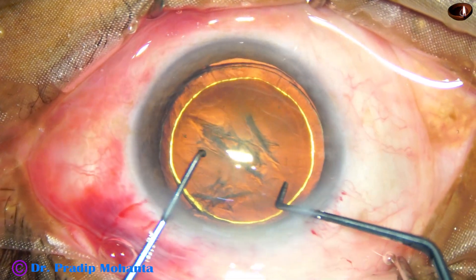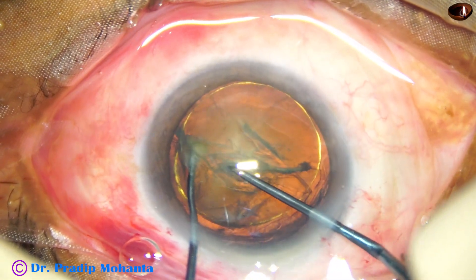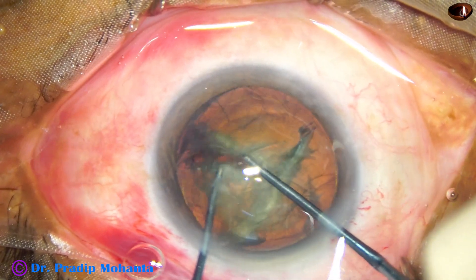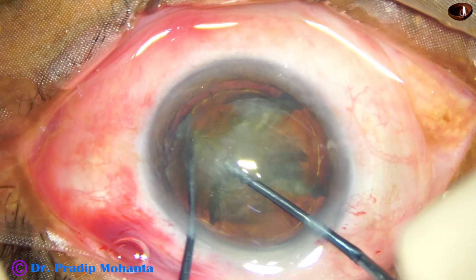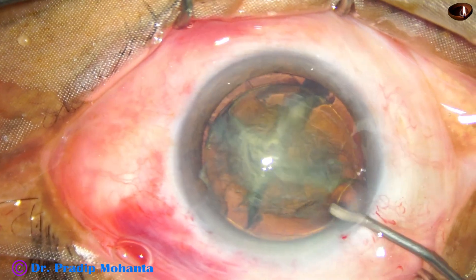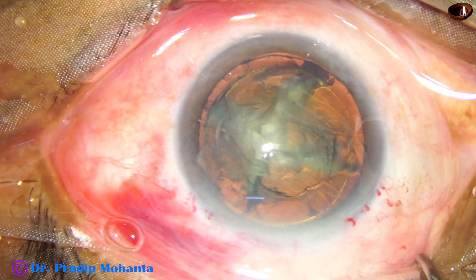Now see the use of pre-chopper. The nucleus sustainer supports the equator and the nucleus, and the pre-chopper cuts the nucleus into pieces. In this case, we have cut the nucleus into four pieces in a very short time, maybe in less than one minute. This is the beauty of pre-chopper in soft cataracts.